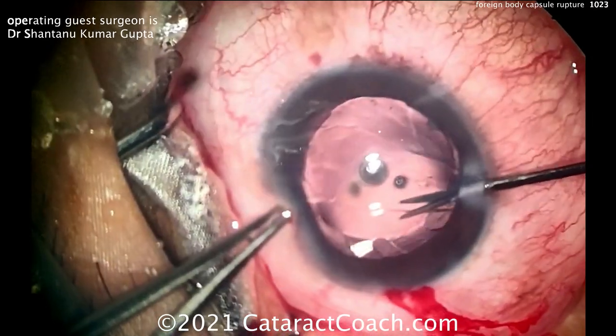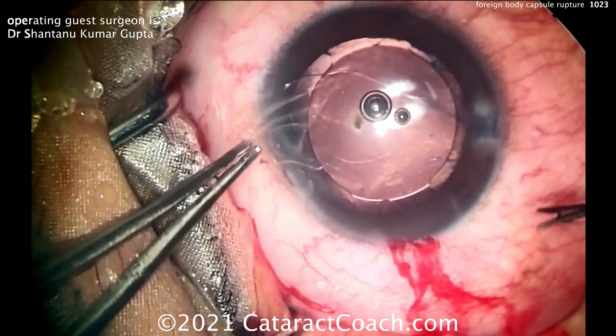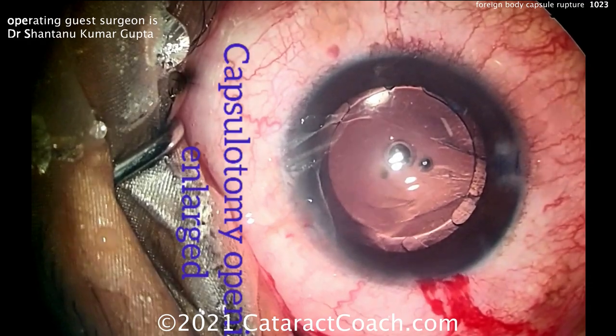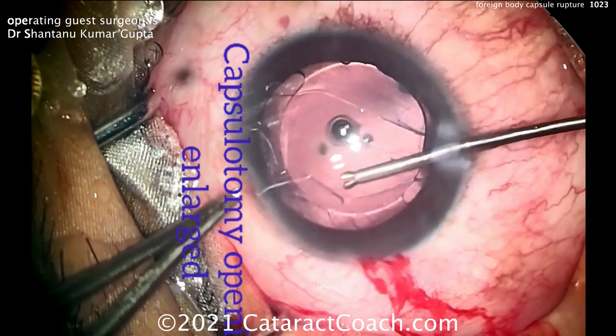It's important to make sure there's no other foreign body stuck in the eye — make sure there's nothing in the vitreous. Examine very carefully, and of course with any of these trauma patients, always examine both eyes. The normal eye can sometimes have a foreign body as well.